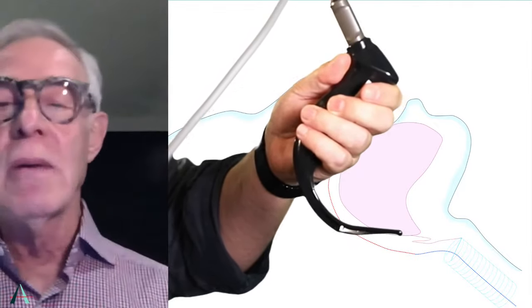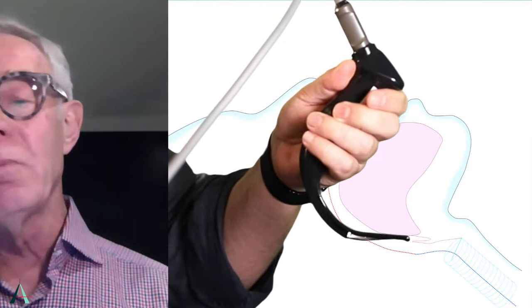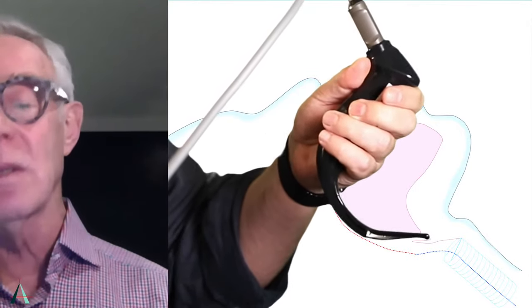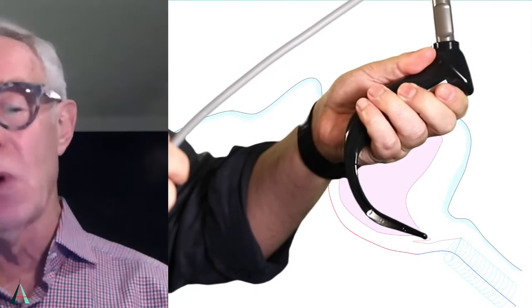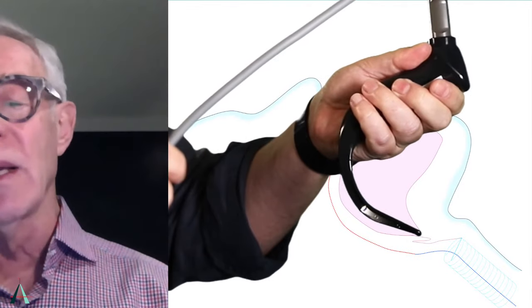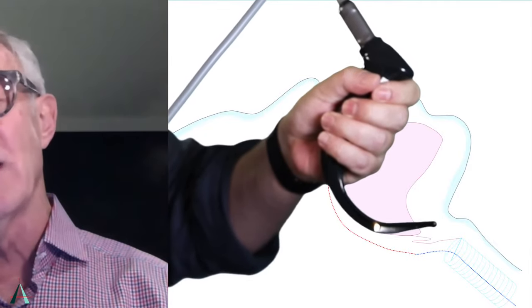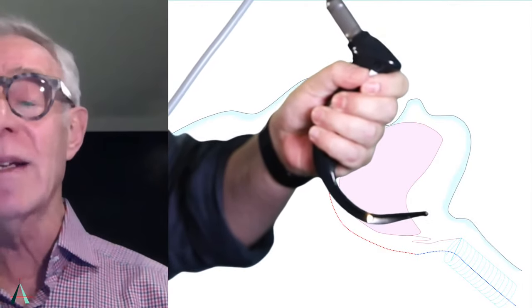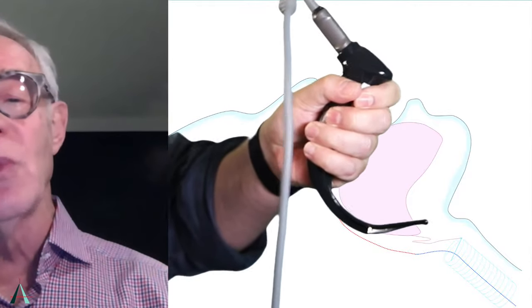Okay, I think to begin with, why don't we contrast the technique with conventional direct laryngoscopy using a Macintosh blade. I think what most people do who grab a laryngoscope blade is they introduce the blade deeply into the vallecula, and they pull upwards or toward the feet in order to optimize the laryngeal exposure. So when you do that with a hyperangulated blade, into the vallecula, and then pull up in the manner you would if you were doing direct laryngoscopy, what you do is you pull up on the laryngeal axis. So you deflect the trachea so that it's oriented more toward the ceiling. If you could demonstrate that with the syringe the way you did before.